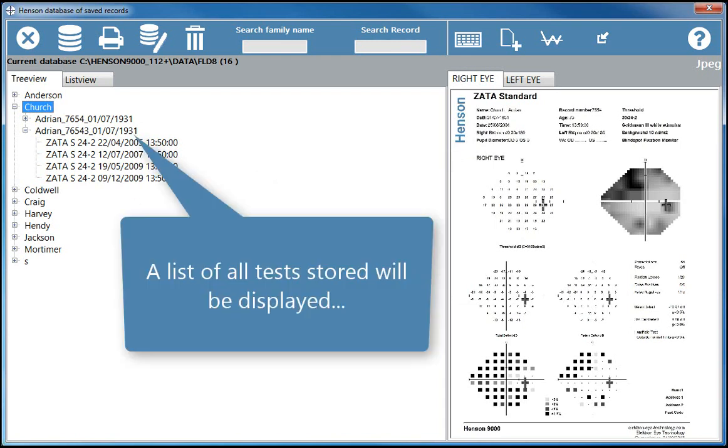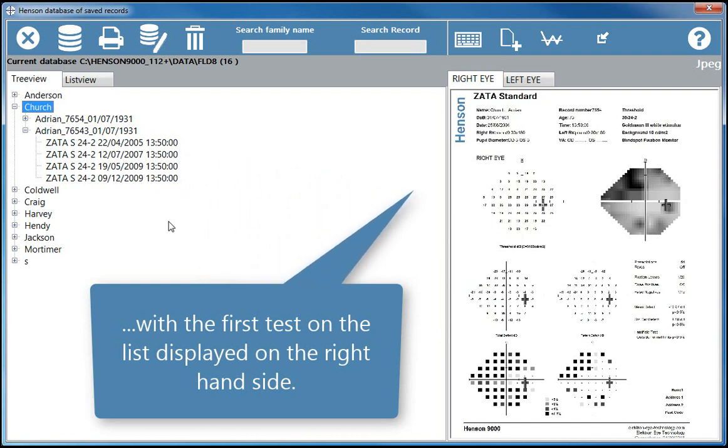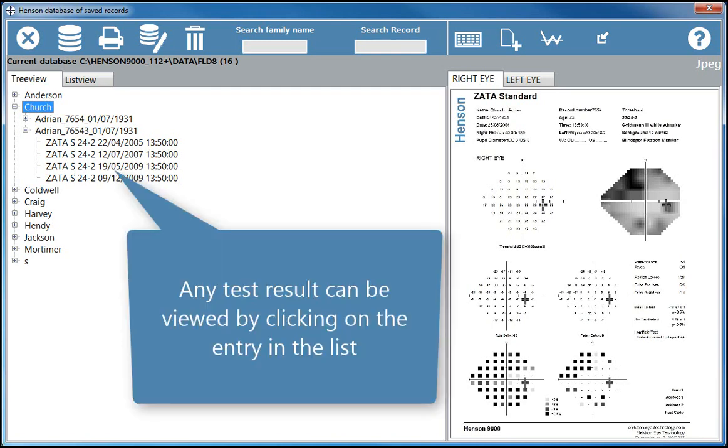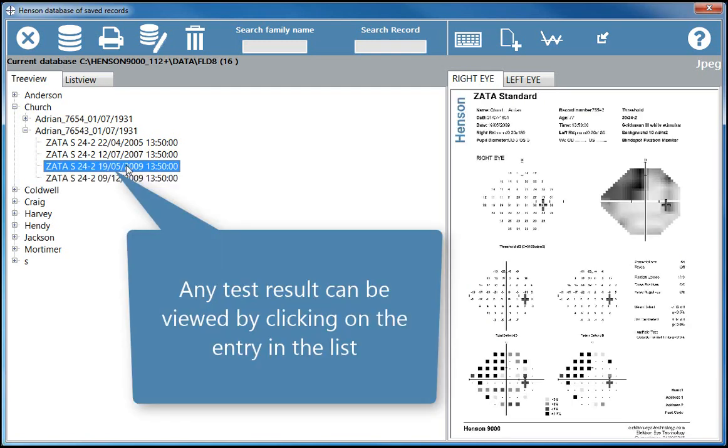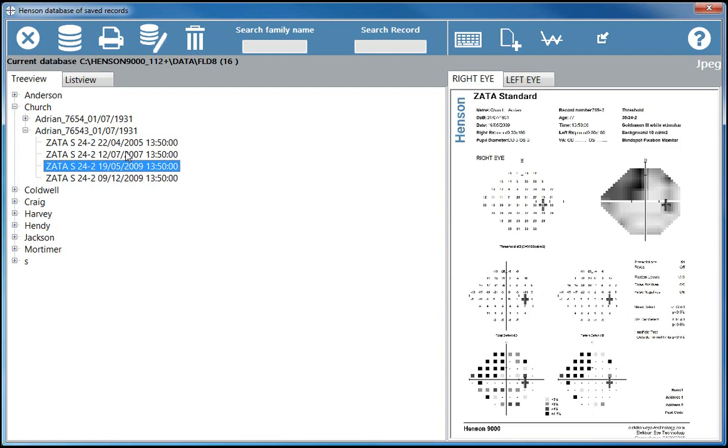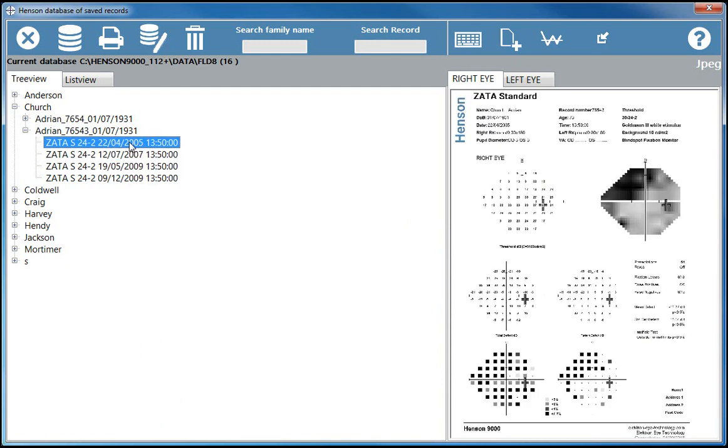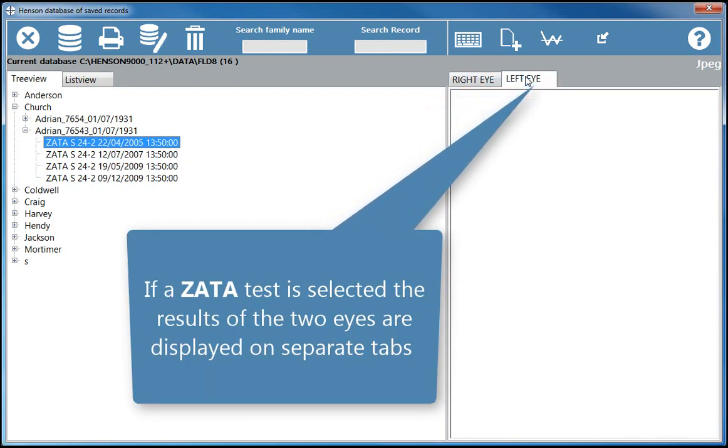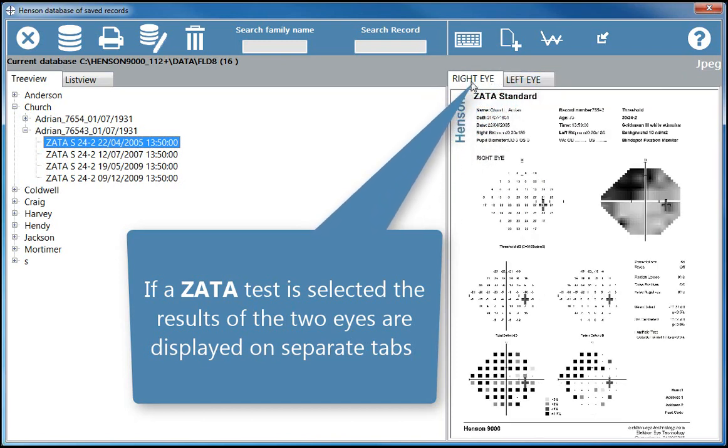A list of all tests stored will be displayed, with the first test on the list displayed on the right-hand side. Any test result can be viewed by clicking on the entry in the list. If a Zata test is selected, the results of the two eyes are displayed on separate tabs.